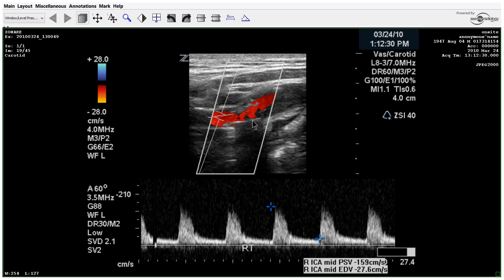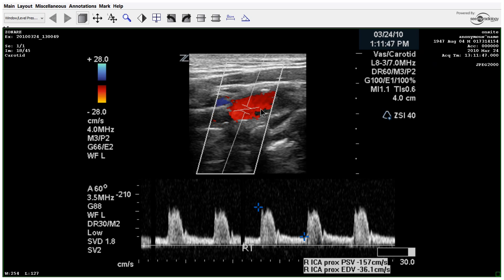Here we've taken what appears to be just beyond the plaque, but I would have preferred taking one or two more spectral samplings in here to make sure we captured the highest velocity. It's still a good representation at 157 over 36. We'll assume where they stopped the image was actually parallel to the wall, though the angle could definitely be improved.